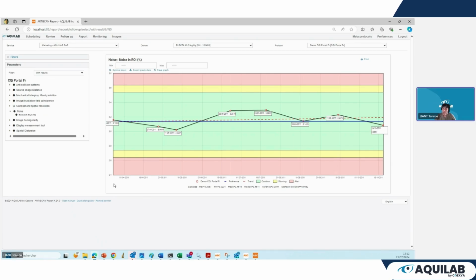So this is a quick overview of what ARTISCAN can do in clinical routine, and I will pass to David for the presentation.